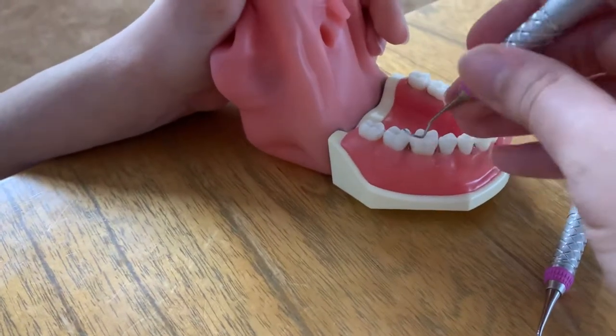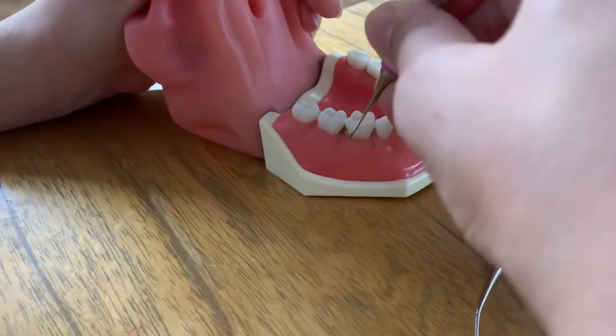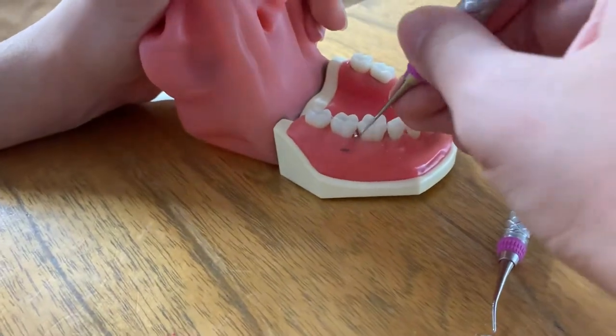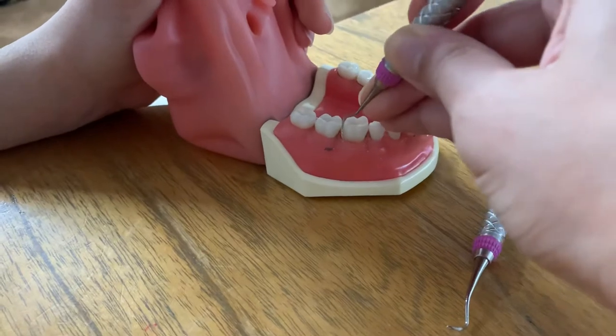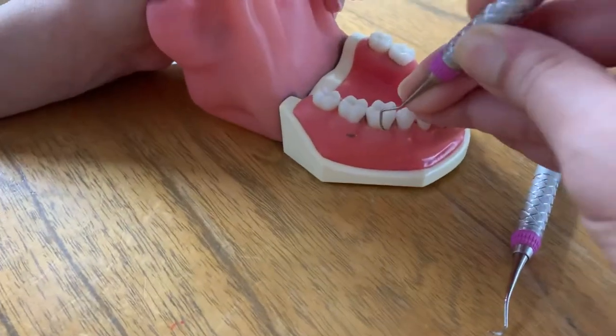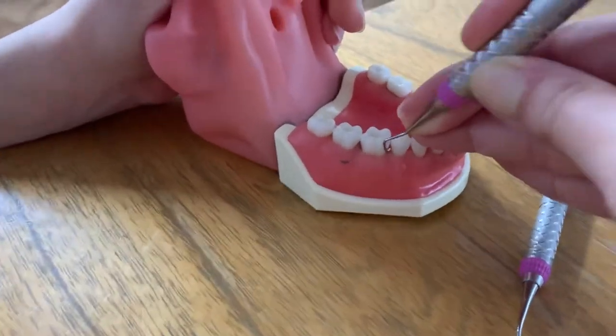I'm going to do the same thing for this tooth right over here — insert, open, activate. I'm going to try my best to stay subgingivally. Look at that — we've got a big chunk right over there coming off. And then I'm going to do the same thing: distal line angle, stay subgingivally using the toe third of the instrument. We're going to rock and roll and end up interproximally.